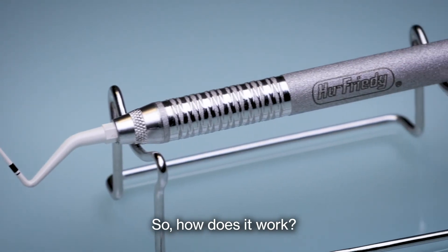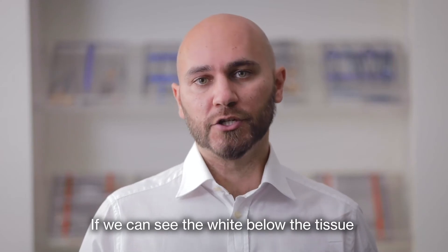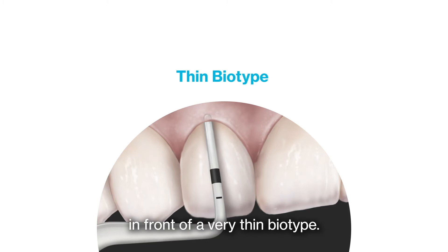How does it work? It is very easy. We start probing with the white tip. If we can see the white below the tissue, it means that we are in front of a very thin biotype.